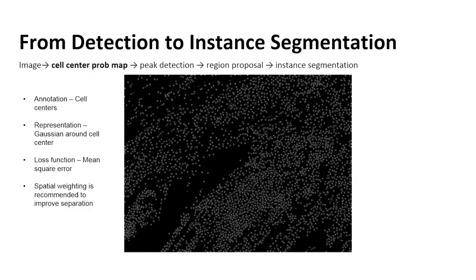The way we operate it is to have an annotation team of sort of semi-experts and have them guided by a pathologist, but you don't want your annotation team to work so hard in clicking all these cell centers as well, which is why usually the best way to do it is sort of a bootstrapping approach. So you have some rough algorithm. It could be a classical algorithm using thresholding that you play around with a little bit. It can be a standard, even an open source tool, or it can be a neural network that you've trained maybe on very little data at first. You have these results, and then your annotators need to obviously throw out the errors and mark the ones that are missed, or maybe even identify only challenging regions and annotate those by hand, and that can save a lot of time. And this is key in developing these solutions quickly and robustly.